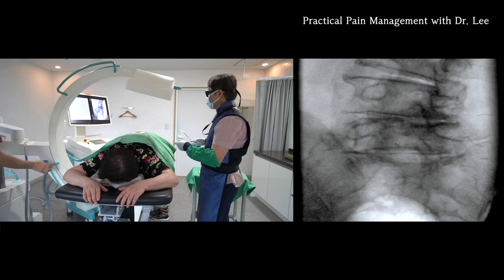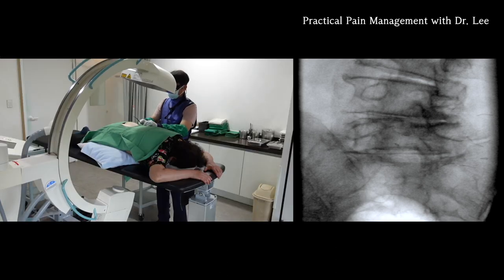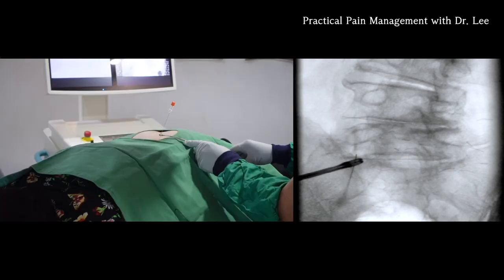Let me turn to the ipsilateral oblique view. It has a clear margin and opening.